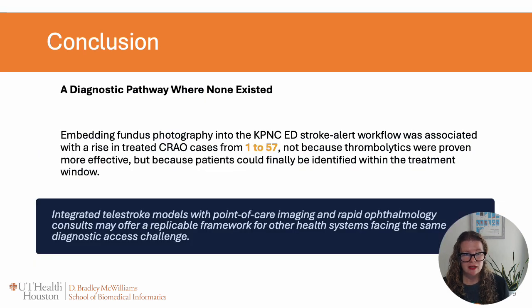Overall, our study did find that integrating fundus photography as a point of care imaging and in combination with rapid ophthalmology consult in a remote setting, we did have an improvement in CRAO diagnosis and treatment. However, we need to see how this could be potentially replicable in other frameworks for other health systems facing the exact same diagnosis and access challenge.